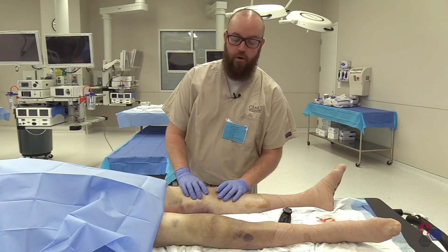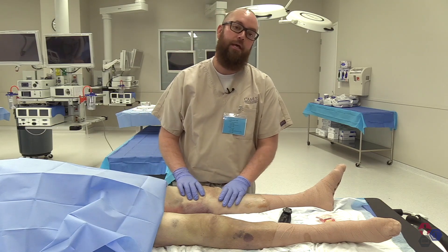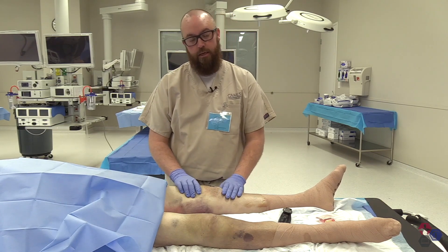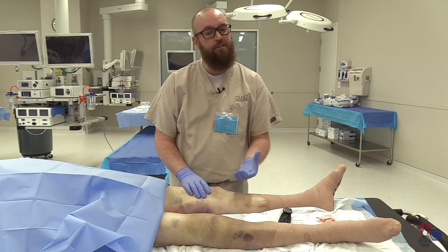There are no absolute contraindications to arthrocentesis. There are several relative contraindications including a cellulitis overlying the spot where you want to break the skin, bacteremia, osteomyelitis, coagulopathy, or a joint prosthesis. But again, these are only relative contraindications.